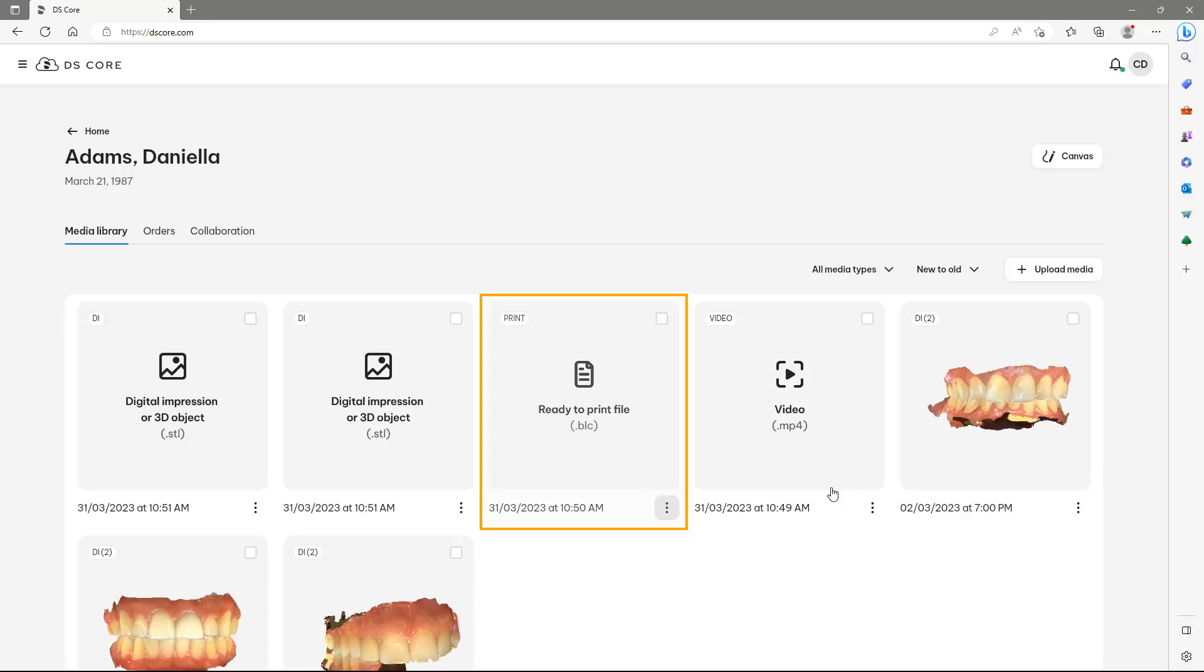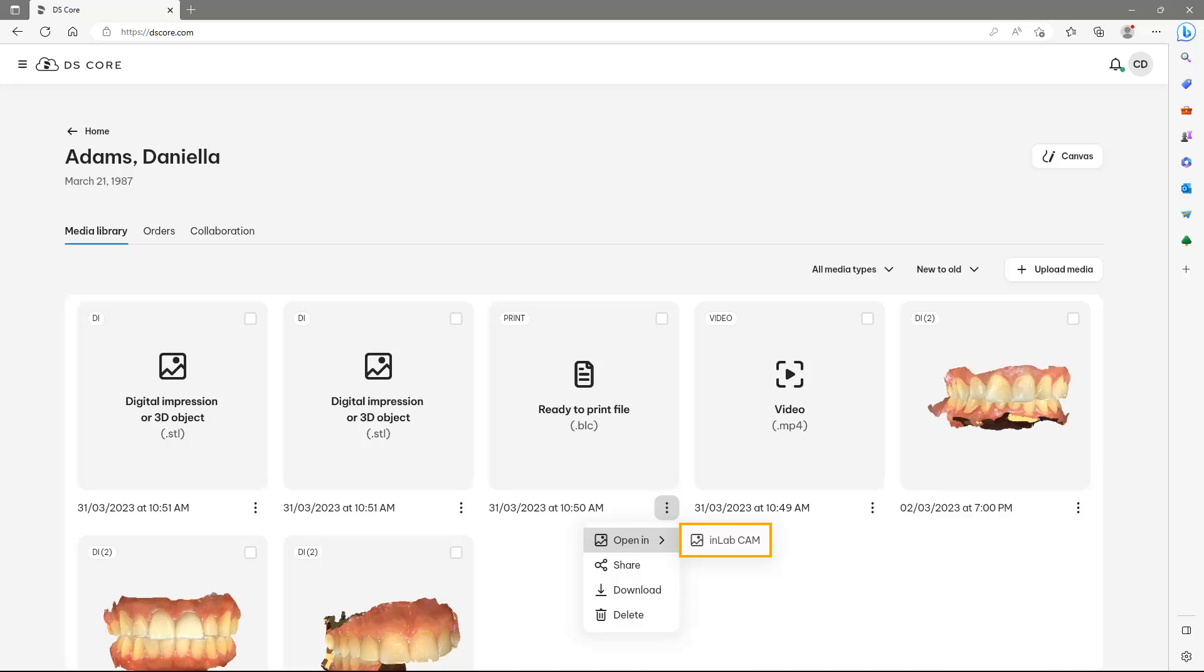In the case of a BLC file, which is a ready to print file ordered through DSCoreCreate, we could open the file automatically in the InLab CAM software.